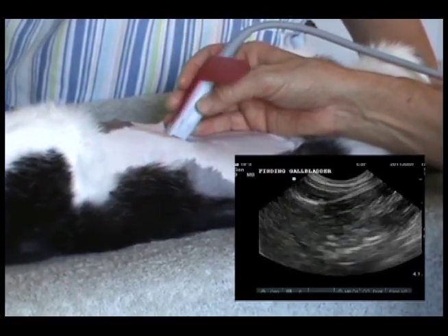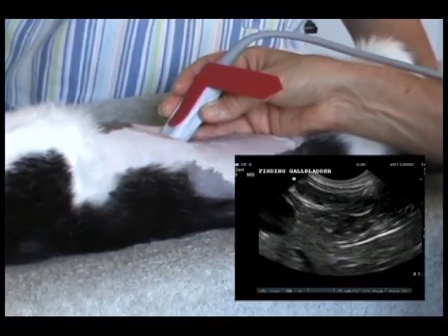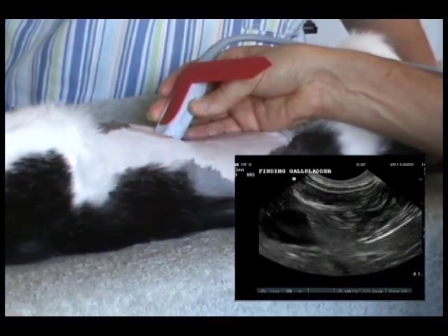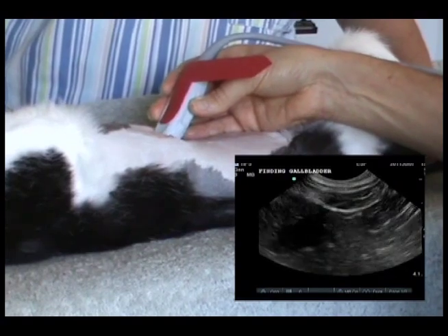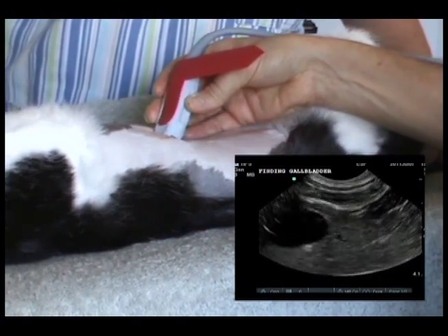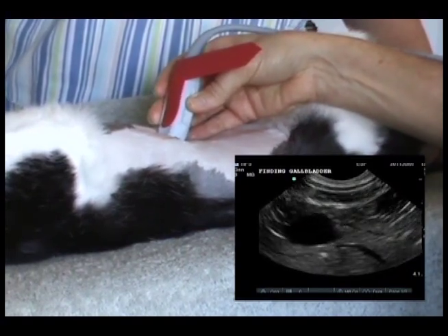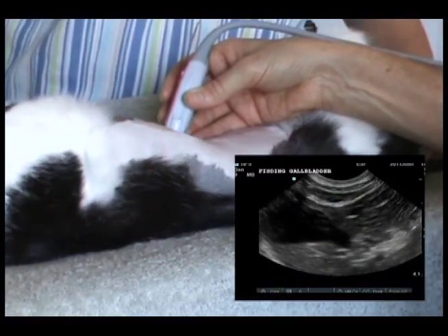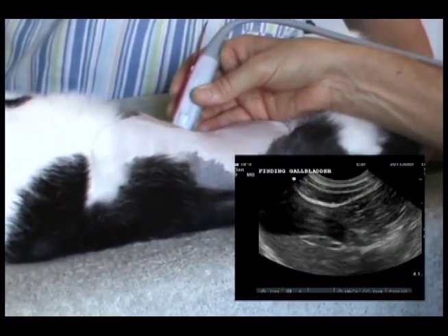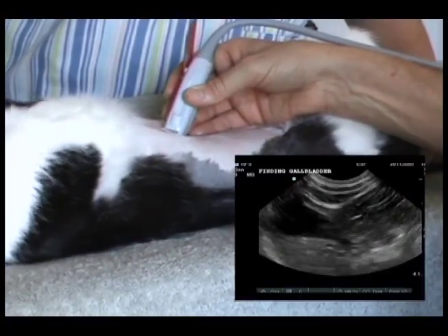If I see or suspect a lesion of the gallbladder, I rotate the transducer to a transverse position, fan cranially, and then caudally to see all of the gallbladder and confirm a lesion in a second view. Then I rotate back to a sagittal or long axis position.